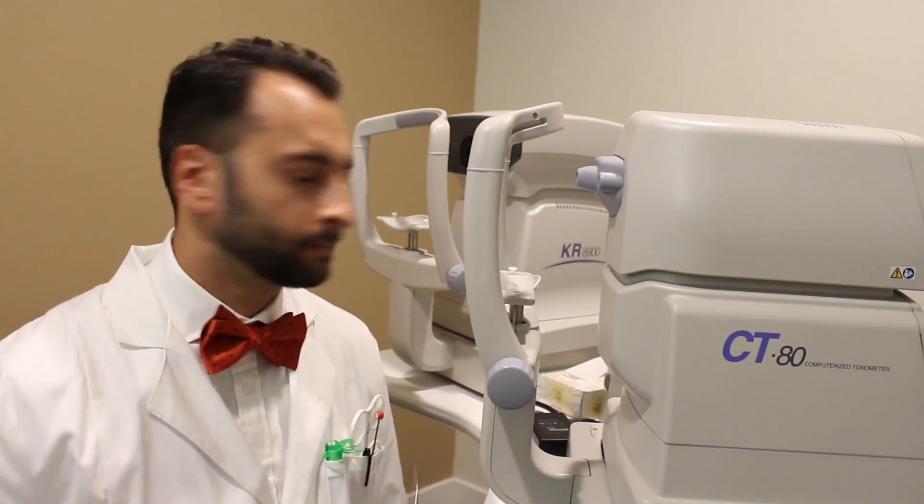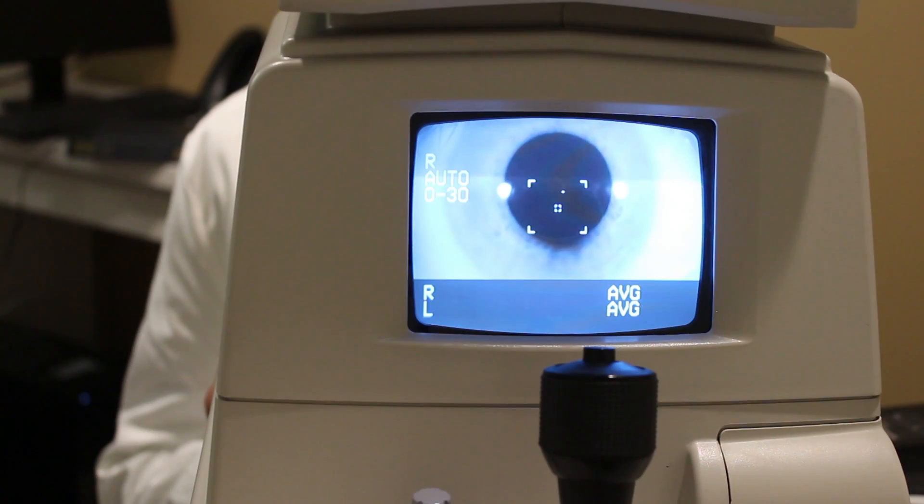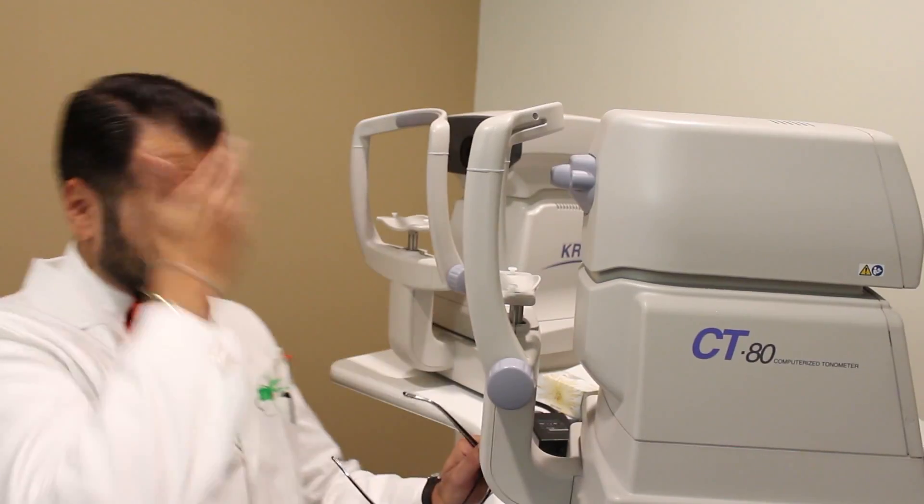Okay, you ready? Here we go. [Air puff test demonstrated.] Was it really that bad? Are you serious? Okay, so we showed you how it works.